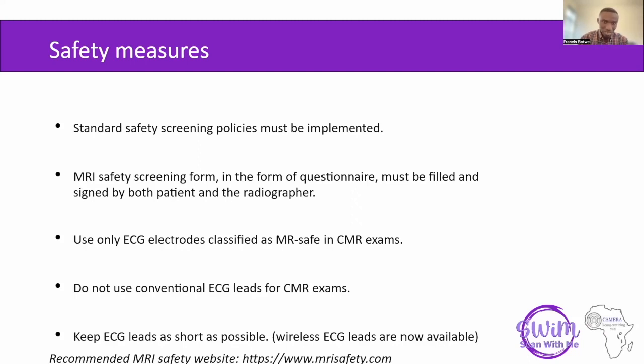Some schools of thought think that once you give the contrast agent to the mother, there's a possibility that it might be transferred to the fetus. And what are some of the dangers in that? Research is still at an early stage on that. But for now, they think it's safe to scan a pregnant woman.